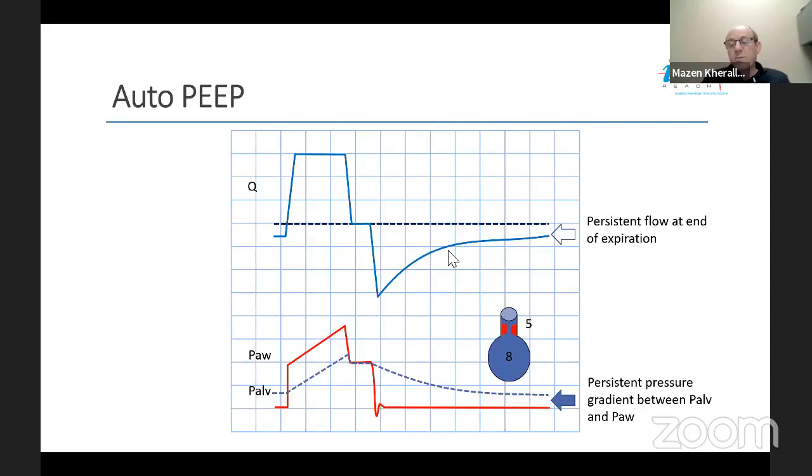But when you have a PEEP of 5 added to the circuit in a patient who's sedated or paralyzed, you're not going to benefit from it. He's got already auto-PEEP. If the auto-PEEP is 10 and you set the PEEP at 5, there's no benefit of the 5. It's not going to overcome the auto-PEEP that the patient has. So there's no value of putting 5.